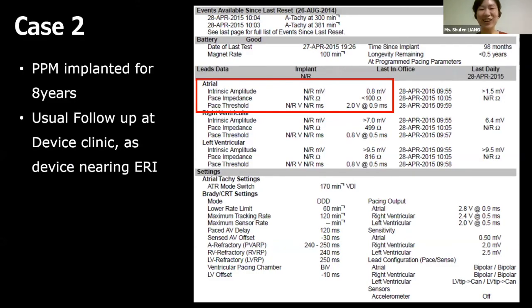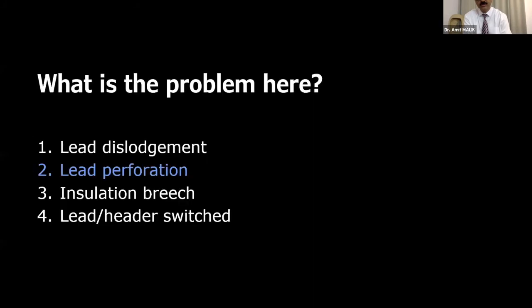So how did you deal with this patient then? We did an extraction in the OT, because the perforation was quite far out. We did a CT, and it showed that the lead was already into the lung. Did she require any hemodynamic support once you pulled out the lead?